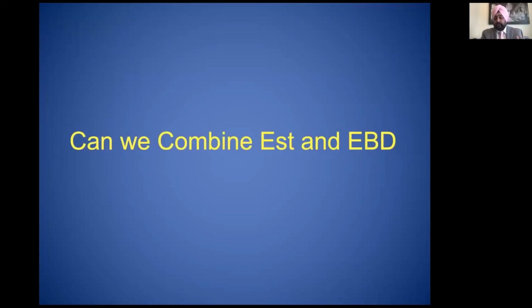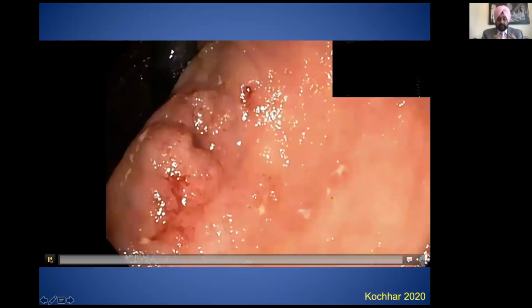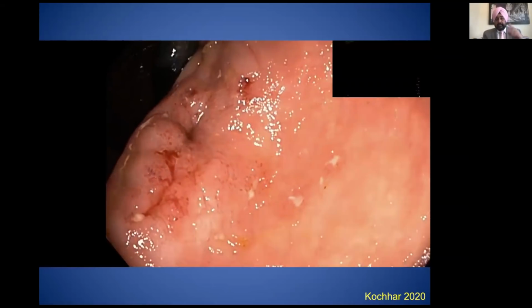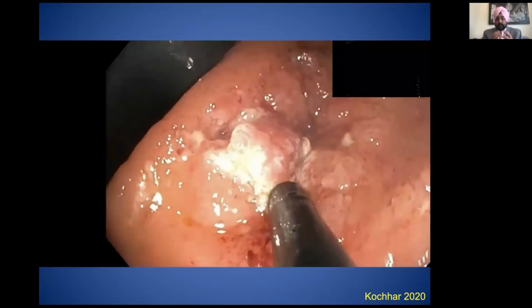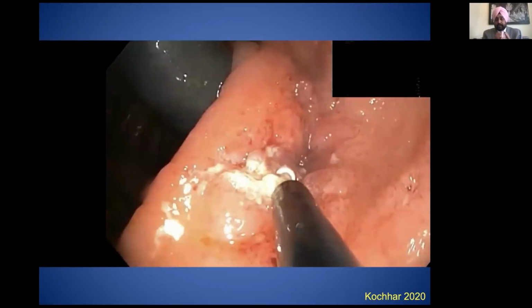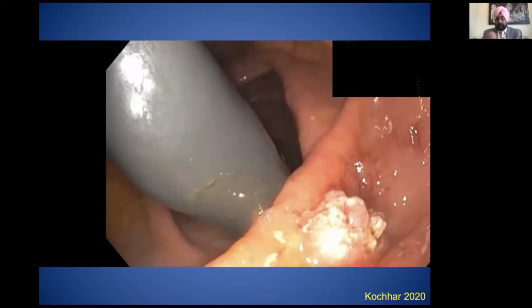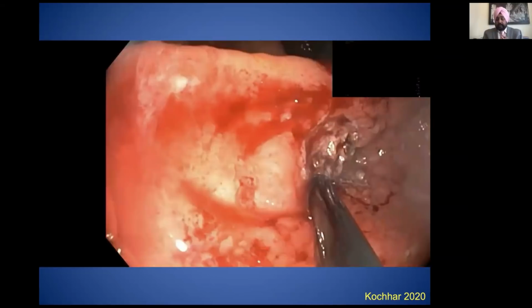Can we combine stricturotomy and balloon? Yes, I have done that. In this video, we will share a difficult, tough stricture at an ileocolonic anastomosis. I initially started to do a knife incision, and I was trying to cut, looking at the fibrous tissue. I was not able to find the fibrous band because the lumen of the small intestine kept prolapsing out. So then I decided to snare off this mucosa of small intestine. And after this was cut, I tried to resume my cutting with the knife.